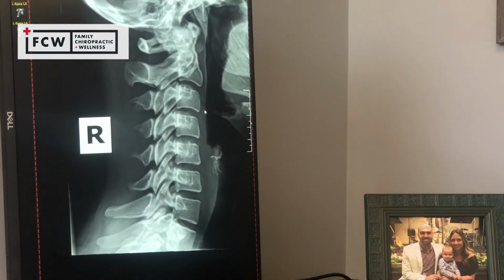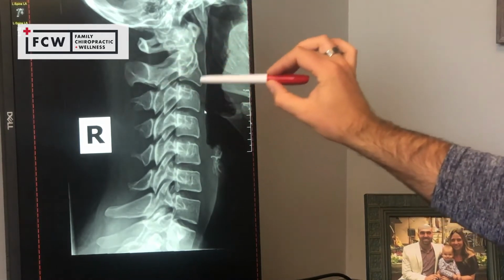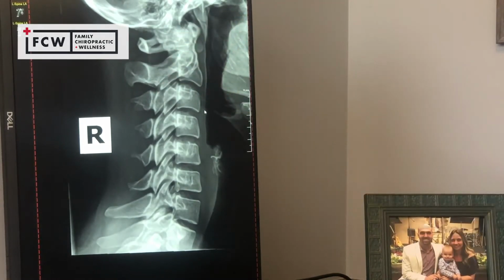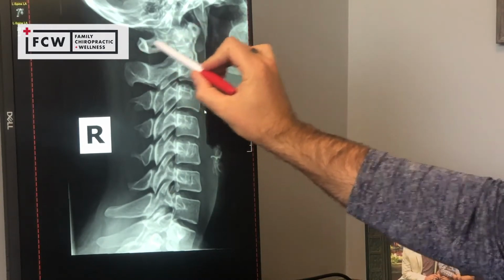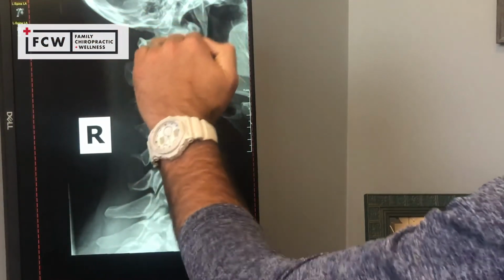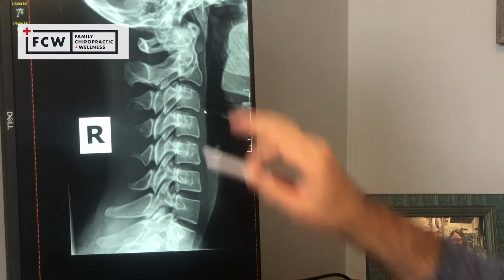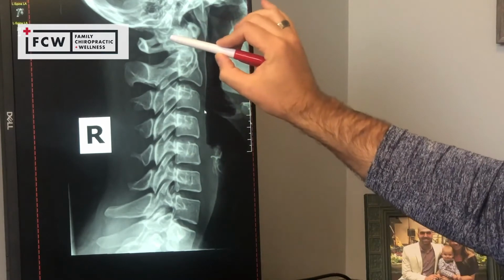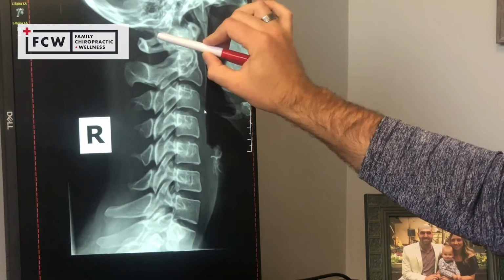When we look at this patient from the side, this is a much better way to confirm what we're talking about in the last picture. This backwards L is that UFO-shaped bone, C2, from the side, and then we can see our first vertebral segment on top of that. If we're taking a picture straight on at somebody with this x-ray, things should look like a 2D image. But on this image, we can see one part of C1 here and the top part behind it here.